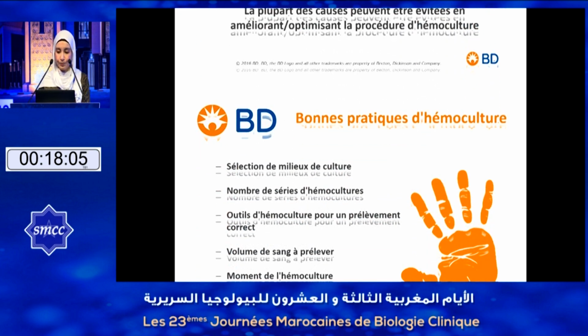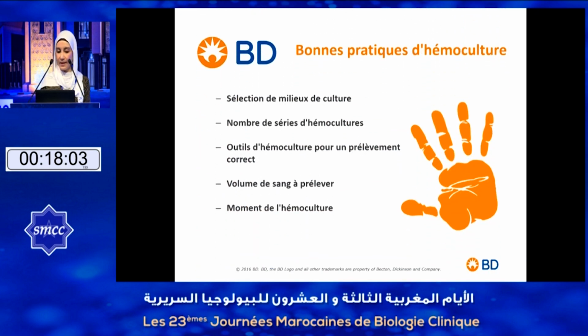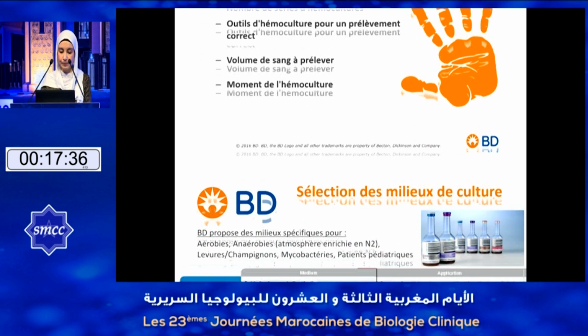Du coup, on est obligé de respecter les cinq bonnes pratiques d'hémoculture. La première, c'est de choisir le bon milieu de culture afin de recueillir le sang. Ensuite, le nombre de séries d'hémoculture, la façon de faire la prise de sang pour l'hémoculture, le volume qui est important, et aussi le moment adéquat.